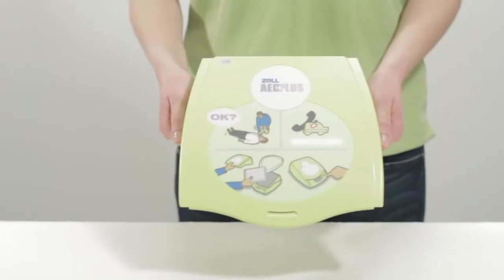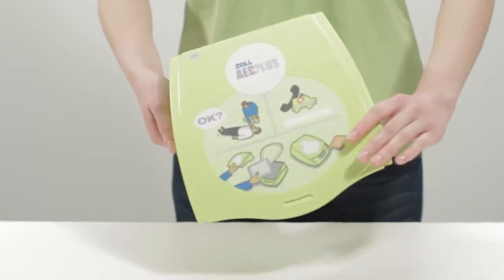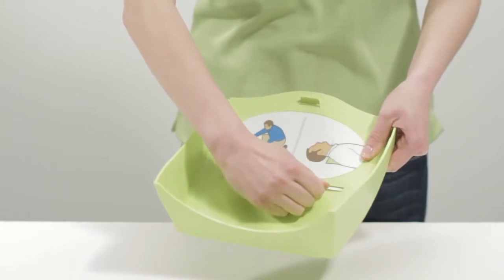Now we'll prepare the lid. Notice the little window with a white background just below the ambulance icon on the cover. It can be used to show rescuers what number to call for help in an emergency. Pull up on this little tab inside the lid and remove it.